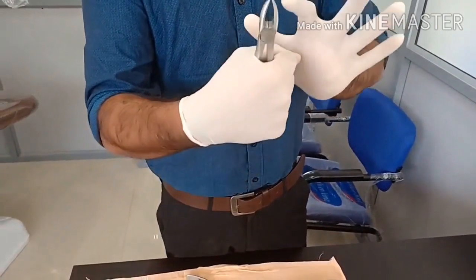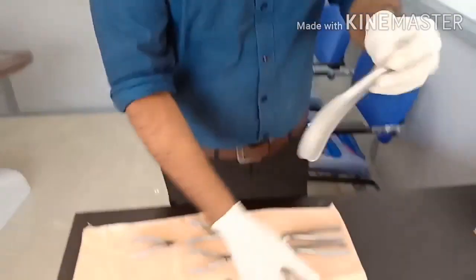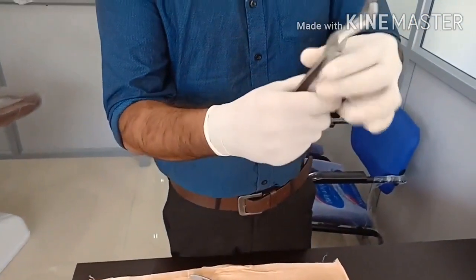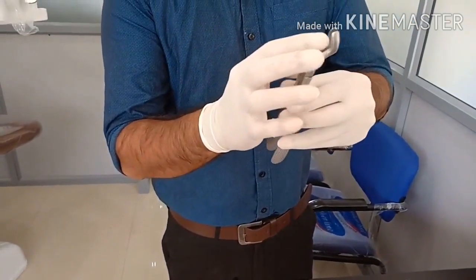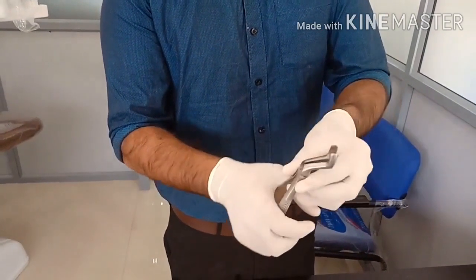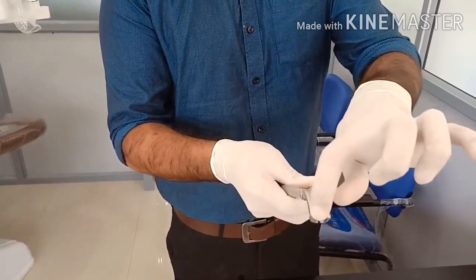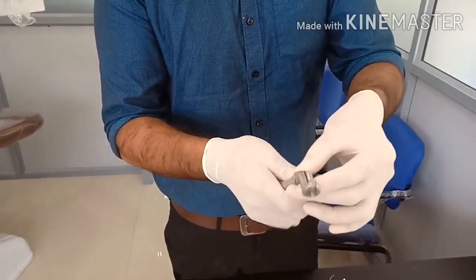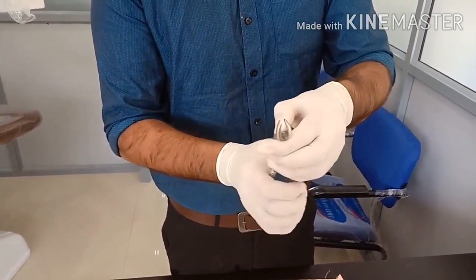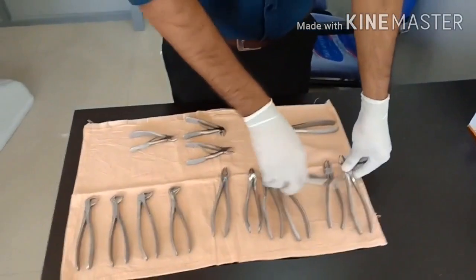This forceps has a particular angulation and is commonly used for third molar tooth extraction. The beaks are almost the same on both sides, so you can use it for both right and left — there is no pair here. Only for molar forceps and molar cowhorn forceps are there right and left pairs.